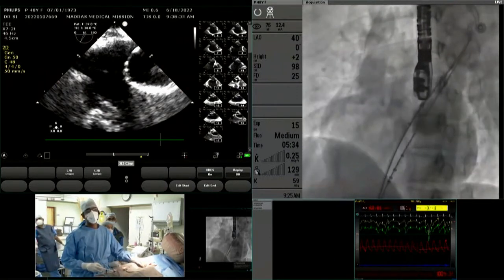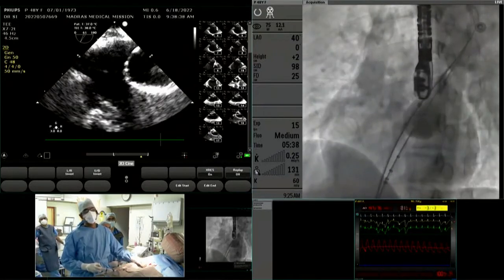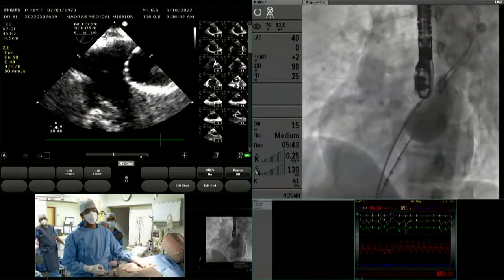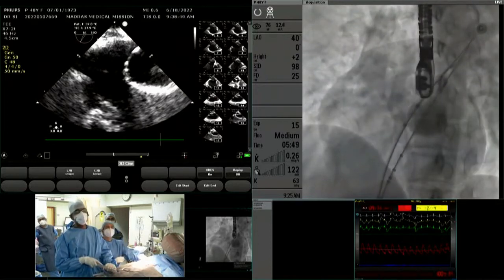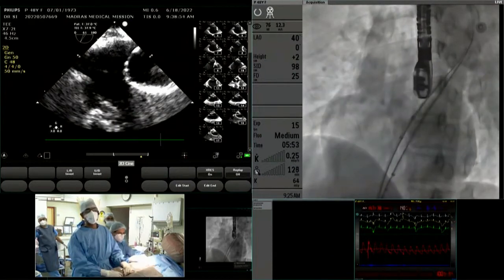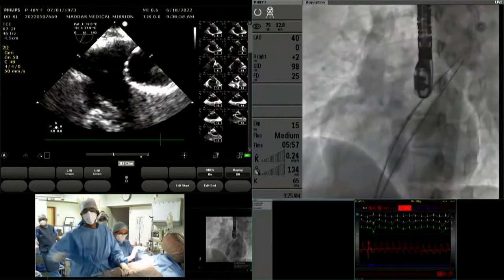we are not having. This looks smaller. Pramod, sir. Okay. Actually, there was, I think, stickiness of this balloon. What is the size of the balloon? The second balloon, I have to pull it out. What is the size of the balloon? 34. The second balloon, actually, I wanted 24, but it was 34. Yeah, it looks big. Just a little bit above.